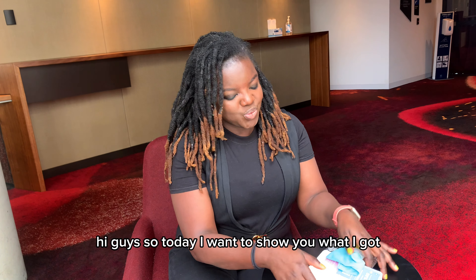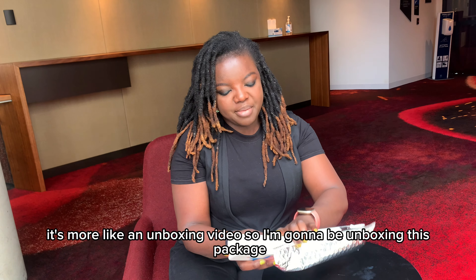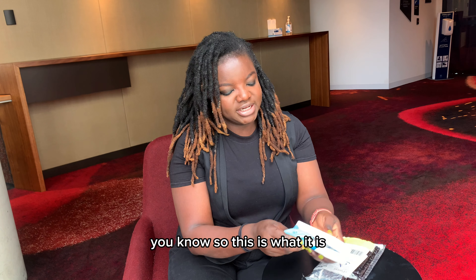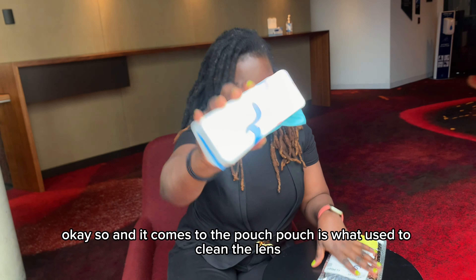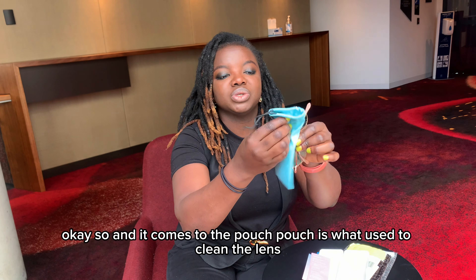Hi guys, so today I want to show you what I got — it's more like an unboxing video. So I'm going to be unboxing this package. It comes with a pouch, which is what's used to clean the lens, as you can see.